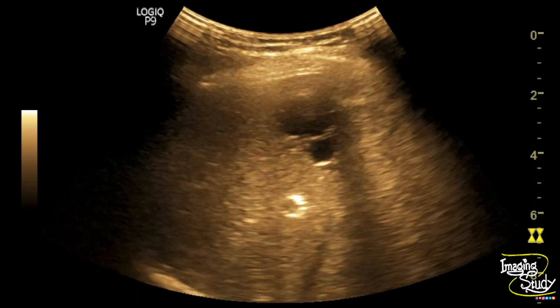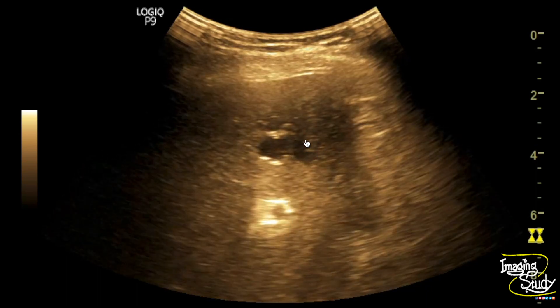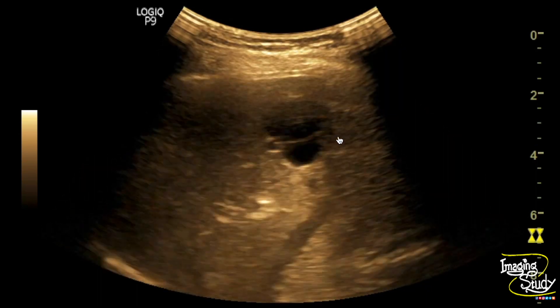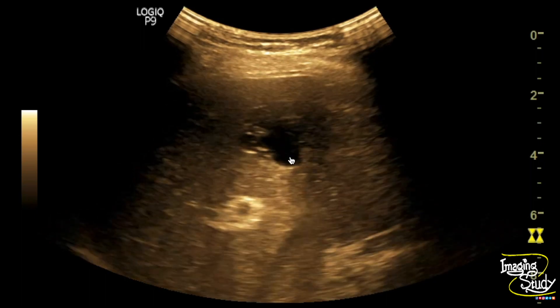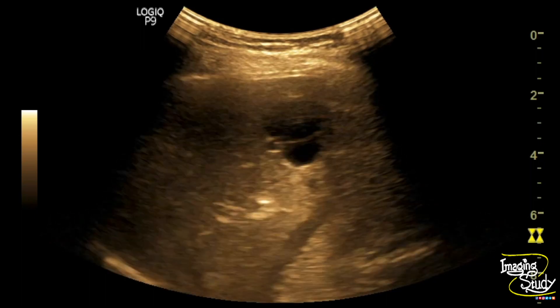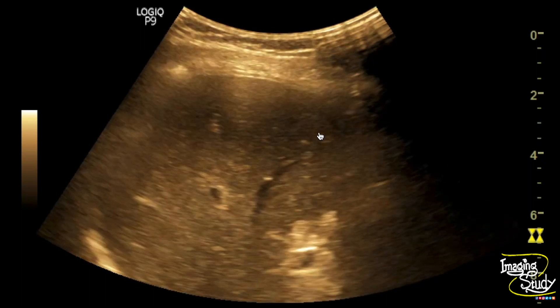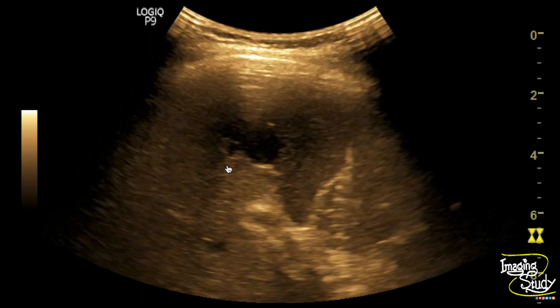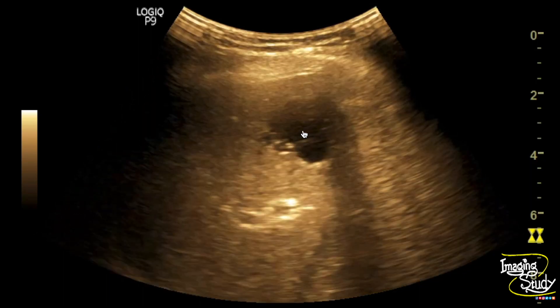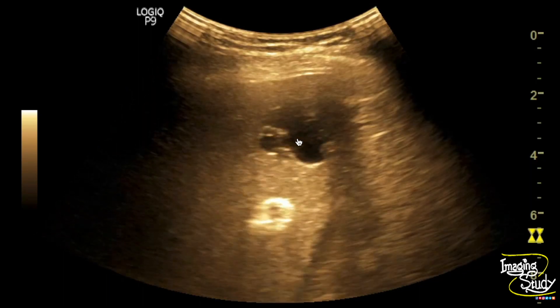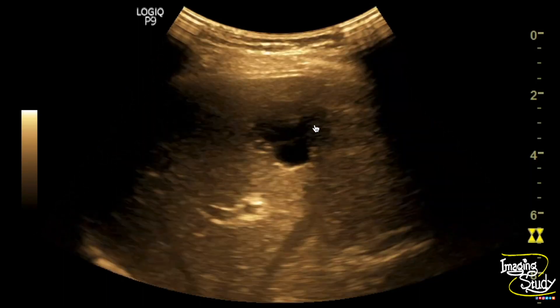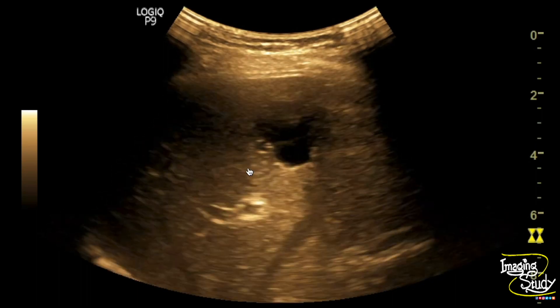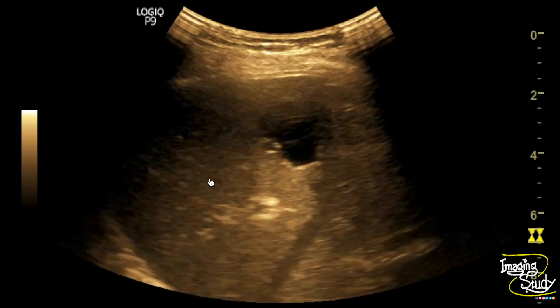Here you can see the part of the liver. It is a magnified image and you can see an irregular anechoic cystic structure at the inferolateral segment of the left lobe. You can see some irregular thin septations within this cystic lesion. On the posterior part you can see a hyperechoic area indicating the posterior acoustic enhancement.